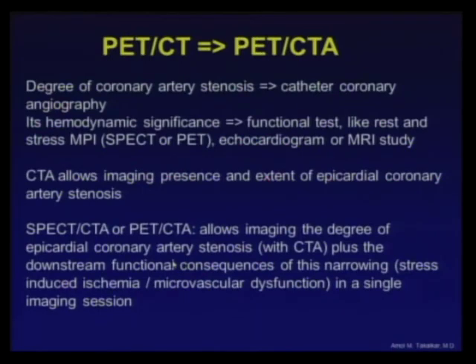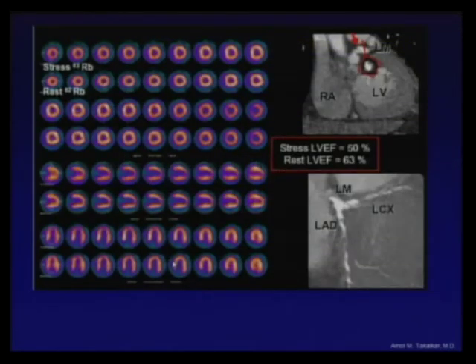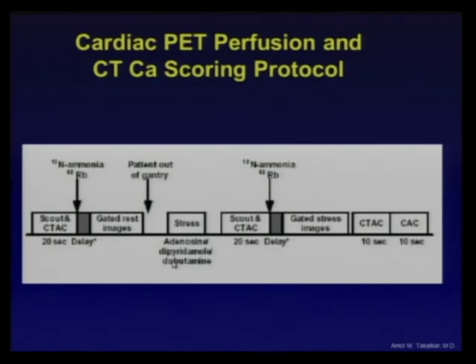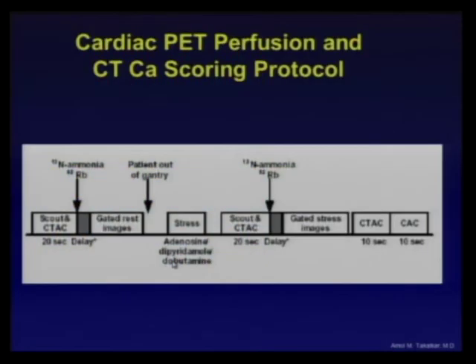Since it's a PET CT, if you have a 64-slice CT as a part of your PET CT, you could technically do an angiogram and have a very wholesome analysis of the patient's perfusion as well as the vessels, and see if there is obstruction and whether that obstruction is having any consequence of reduced blood flow, whether there are collaterals or anything like that. That would be the protocol for that. This is how it would look, and you could throw in the patient's own angiogram rather than a default angiogram to see where the problems are, what territory is involved, what's the culprit lesion and all that stuff.